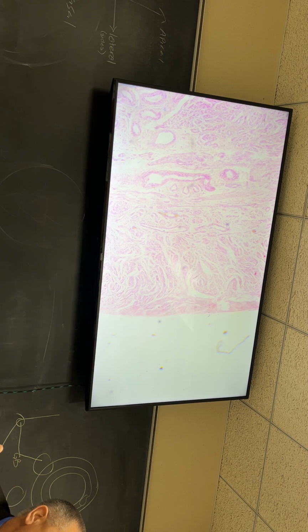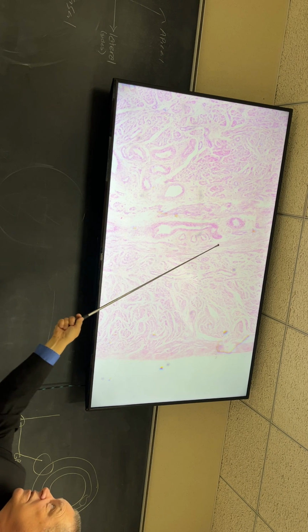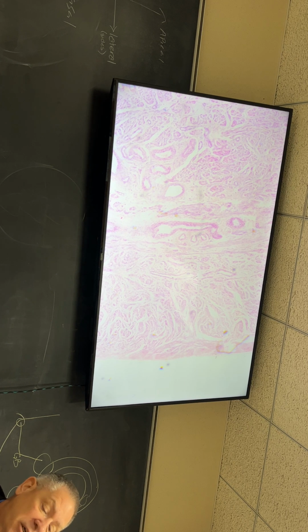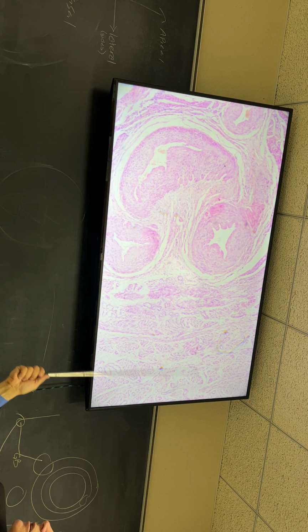What did you see in the myometrium, other than just a big mass of tissue? Look at the way that it's cut. Remember longitudinal, cross cut, all that stuff. Take a look at the tissue. If we see it here, what does it look like? This looks cross cut, right? You agree with that? What about in here? Kind of longitudinal, maybe a little less longitudinal. What about over here? More cross cut, right? What about here? Oh, look at this. We got all kinds of different areas, right?